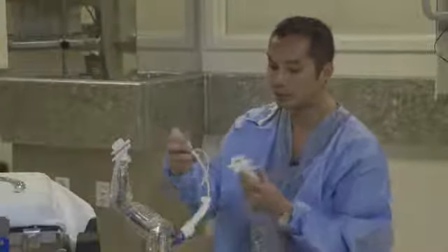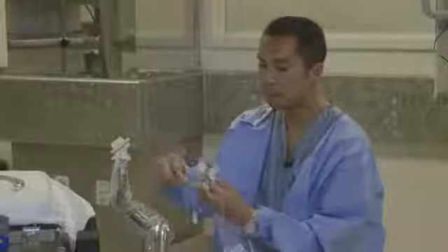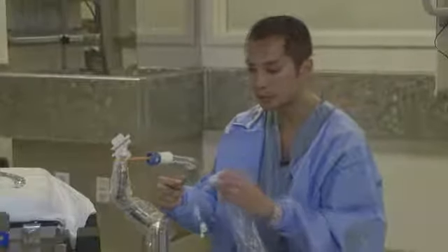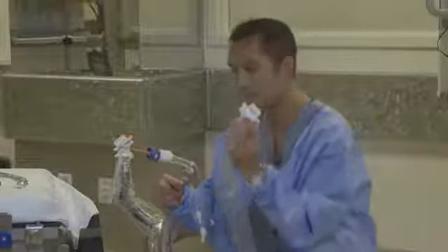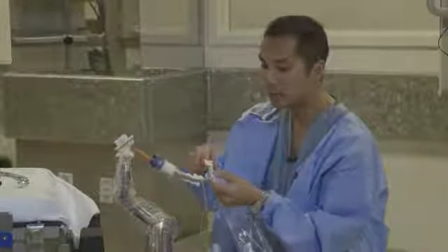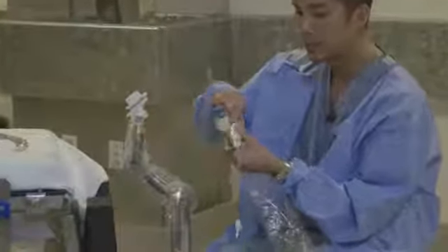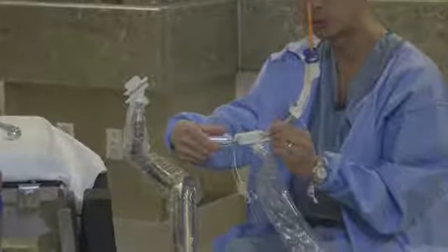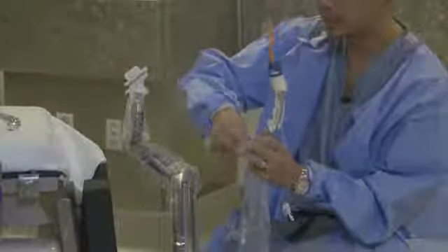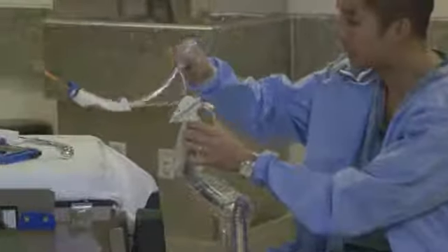And one of the things that you'll notice is that these adapters fit particular grooves within the handles. So in this case, if I'm going to utilize this adapter in this orientation, you can actually feel this thing sit in place when you slide this handle in there, and you're able to lock it like that, right? That's what you want to do. So I'm going to go ahead and take this off of here and show you what that looks like when we mount it on here.